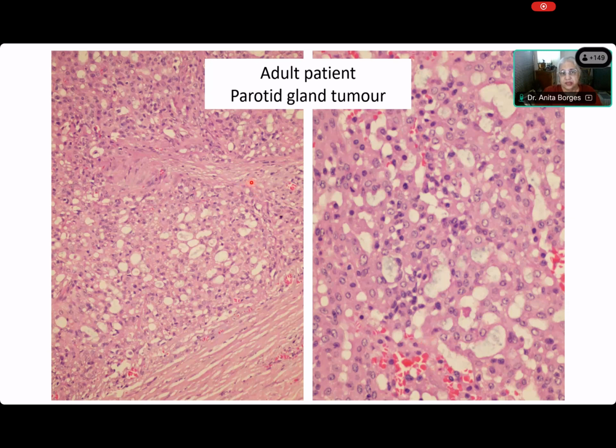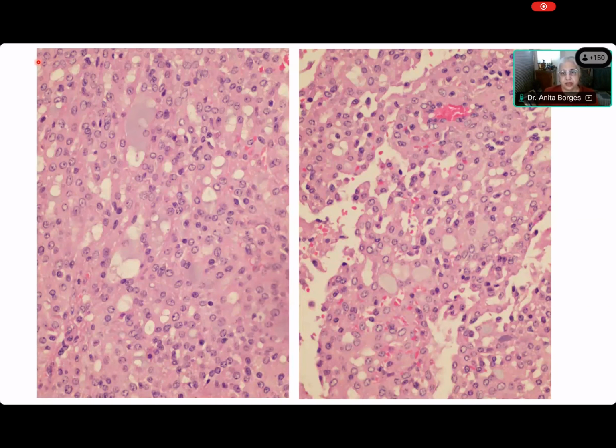And do you notice any cell borders or anything? No, ma'am, the cell borders are very indistinct. So it's almost like a syncytium. The cell borders are very indistinct, and you see these secretions that are sitting. Some of them are blue, some of them are pink, but they're sitting in these spaces that seem to emerge from the sheet of cells. Oh, that's very good. You look at it again, same thing. Can you see? And here you can see some little bluish kind of secretions that are present.